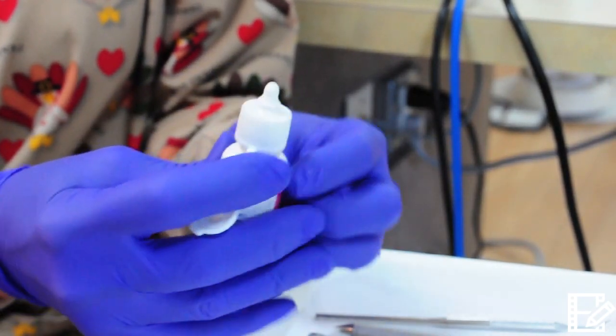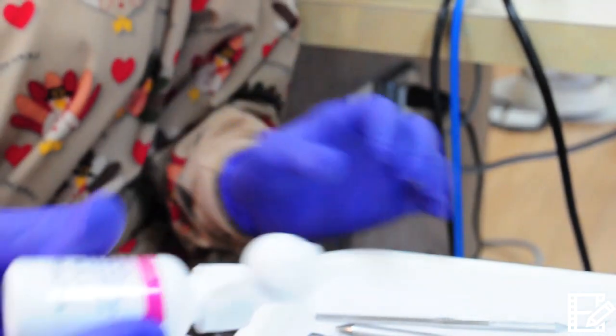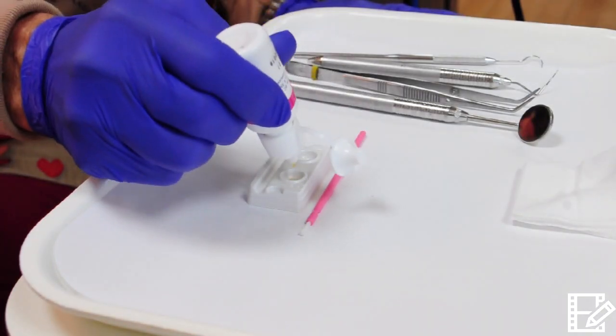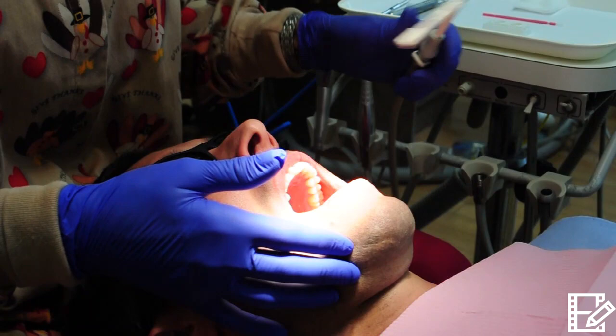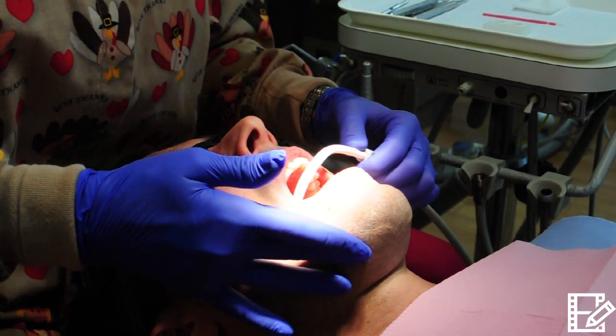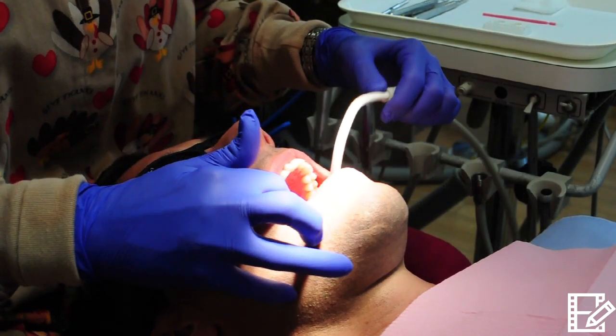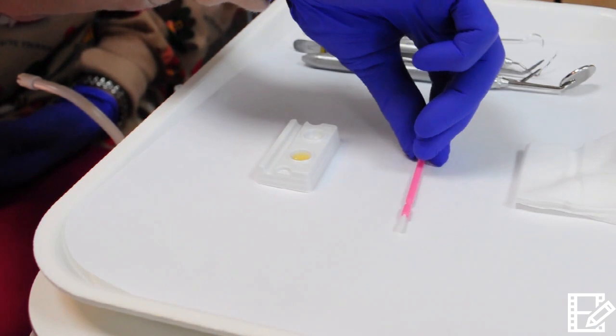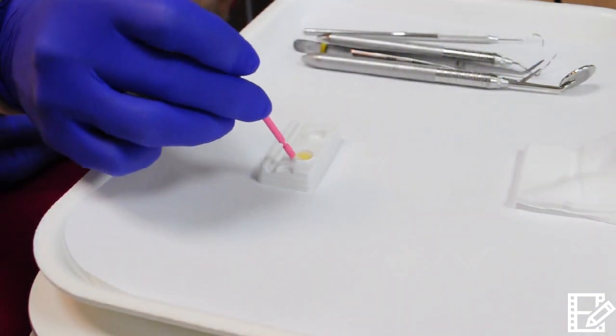Using the bottle system, simply shake prior to use. Keep the bottle clean by holding it straight up and down while dispensing. For primary dentition use one to two drops, for mixed two to three, and for adults up to four drops. Use an alcohol wipe when needed to clean the bottle tip prior to storage. Don't dry the teeth, but do evacuate pooled saliva.